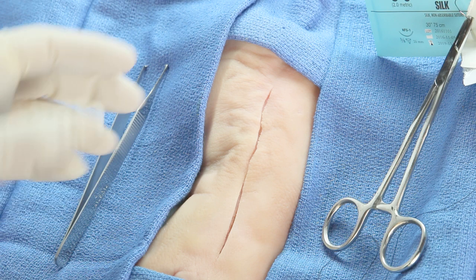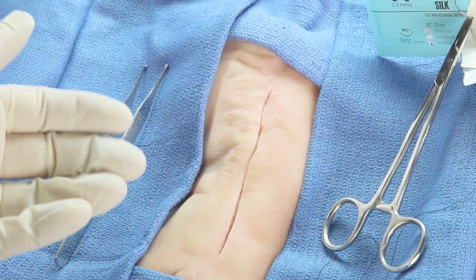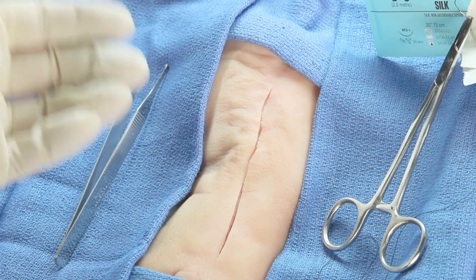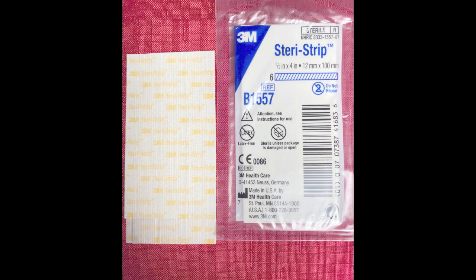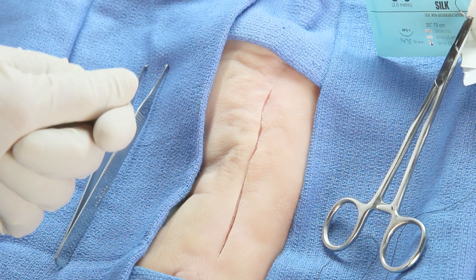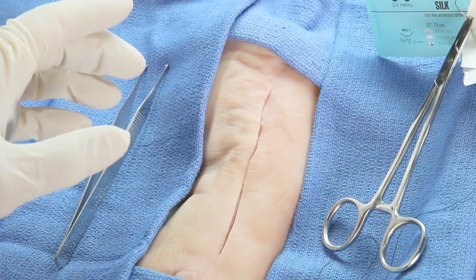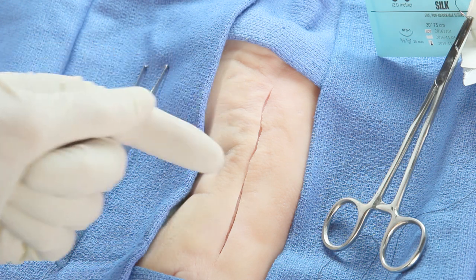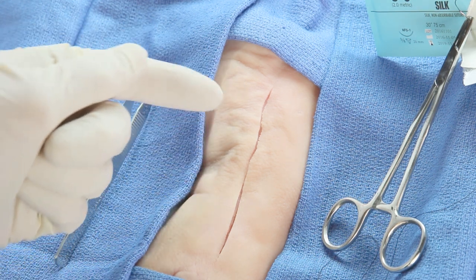When you look at this laceration, it's pretty clear that it's not gaping open and that there's little or no tension on the wound. Better than suturing this entire wound, consider using SteriStrips or other surgical tapes, relatively inexpensive items that can be stockpiled in quantity. There is no rule that says you can't use sutures and SteriStrips in the same closure, and it certainly will extend the life of your limited supply.